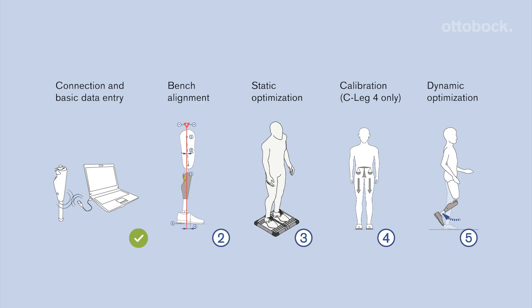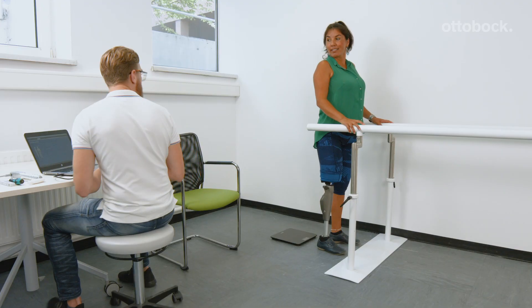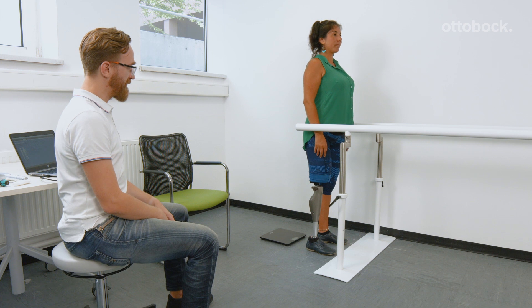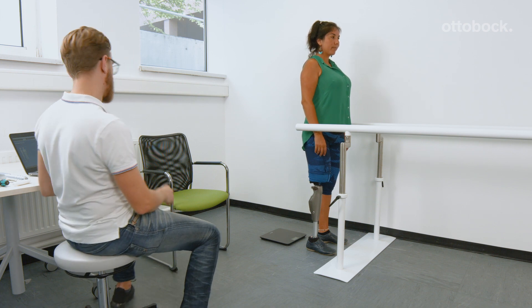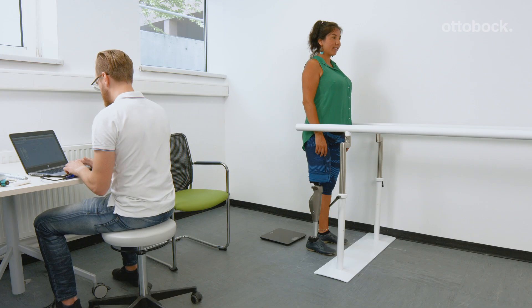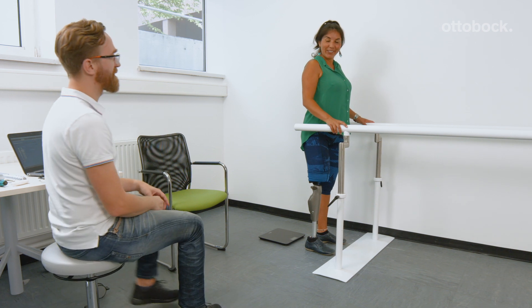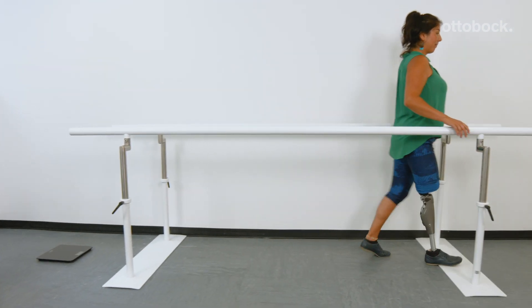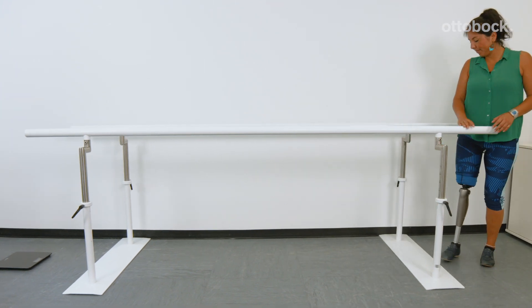After bench alignment and static optimization, it is necessary to calibrate the knee using C-Soft Plus. Do not forget to recalibrate the C-Leg 4 after every change of alignment. The Genium and Genium X3 are automatically calibrating themselves after releasing a few swing phases successfully.